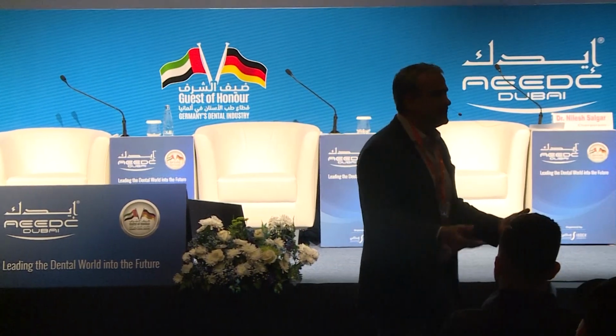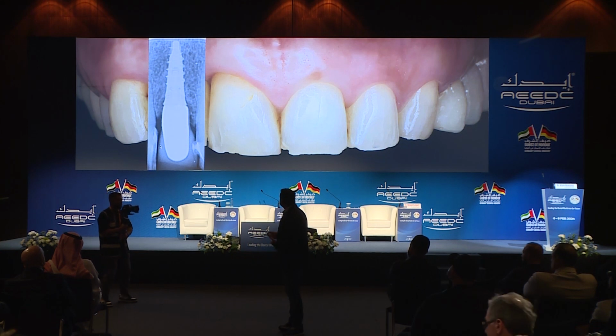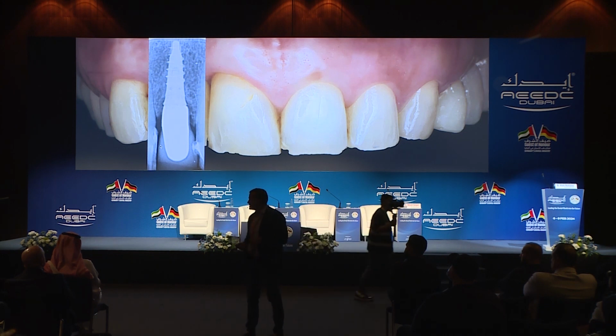So I said, listen, I'm coming to Dubai in February, giving a lecture, so I'm going to do the case to let my friends see what's going to happen, if I can fix this. This implant is really badly placed. When you look at the implant placement, it's too deep, too buccal, and really the interproximal bone, we had to restore the bone on the adjacent tooth in order to have good aesthetics.